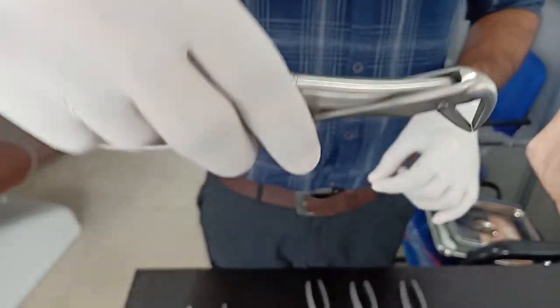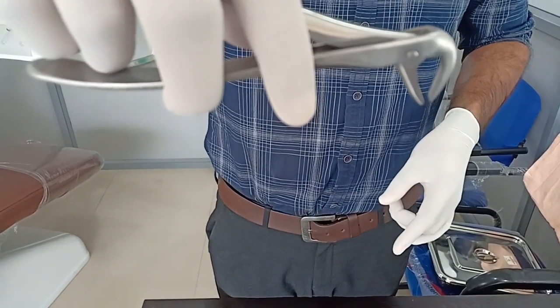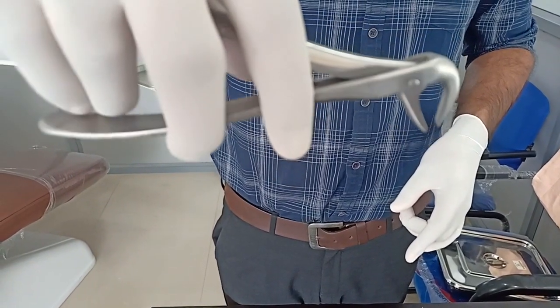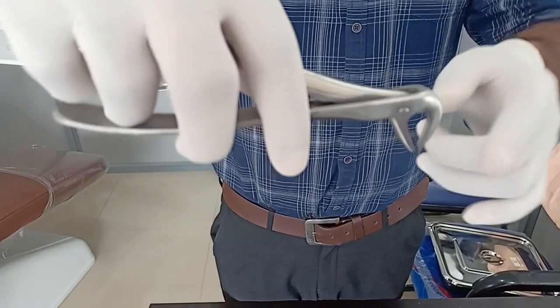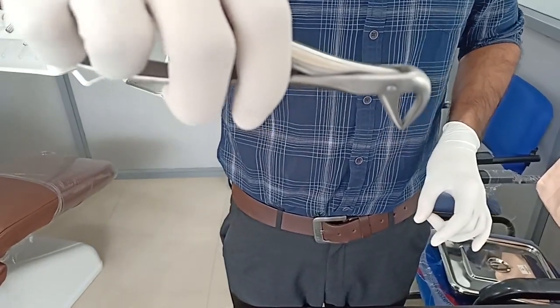As I mentioned in the last session, if the beaks are touching, it will be a root forceps. This is a mandibular root forceps, and any root can be retrieved using these forceps.